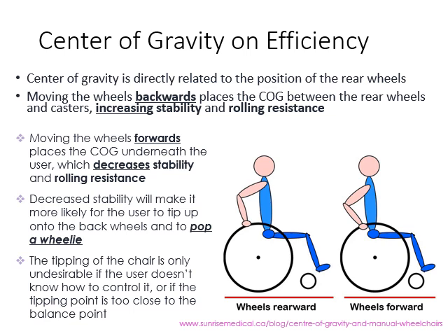In this slide, I want to tell you a little bit about how the center of gravity of a wheelchair can be altered by the position of the rear wheels. By altering the position of the rear wheels, we can make the wheelchair more or less stable, because the center of gravity is directly related to the position of those rear wheels.